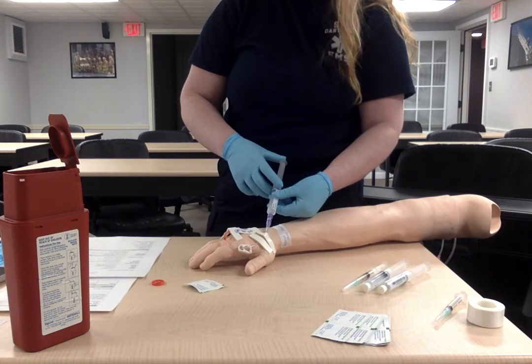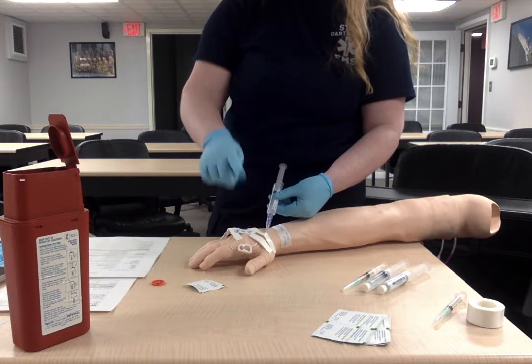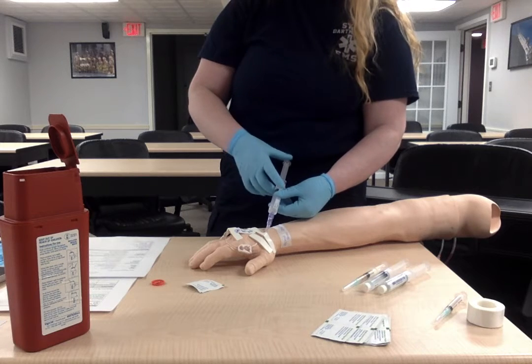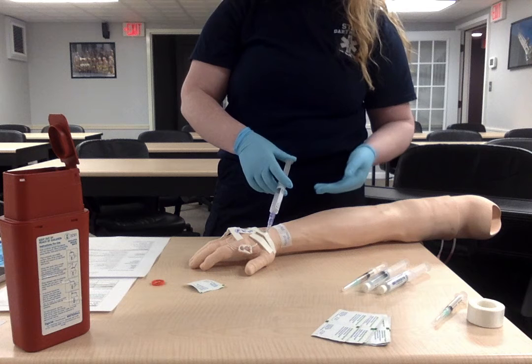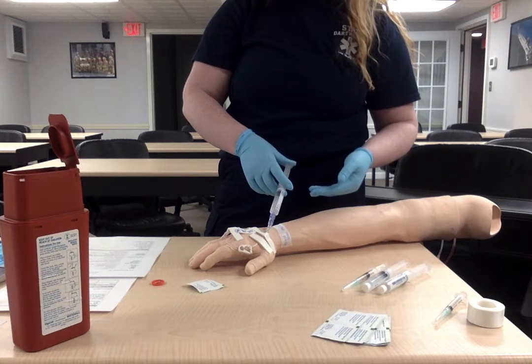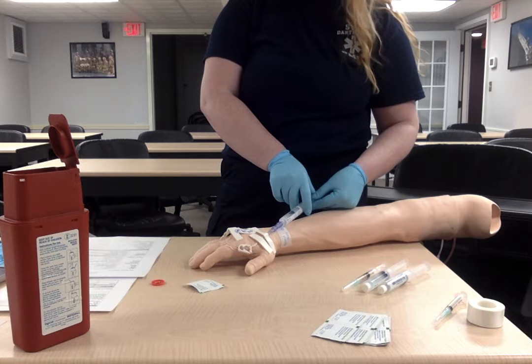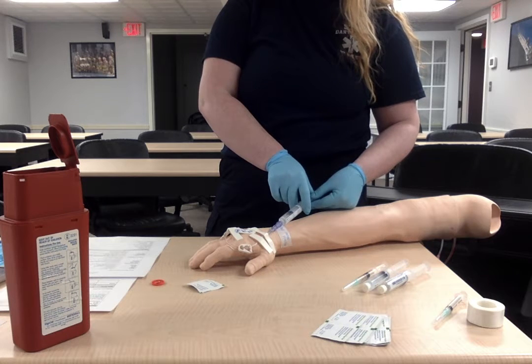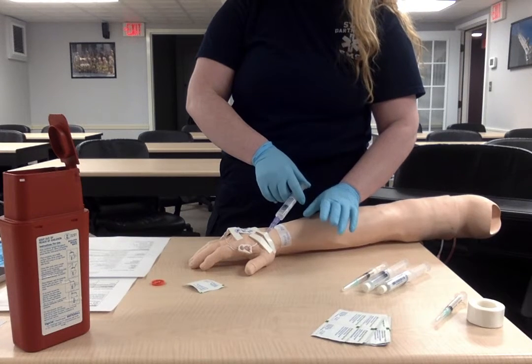We're going to push the 1 to 3 mLs to clean out the lock, just to make sure we don't have any resistance. If you do find resistance, make sure that the clamp is undone, and you never want to push through. So this is just to determine that it's patent and to make sure that we don't have any issues and that we can flush it easily, because we don't want to force that. So there's no swelling, no discomfort as we're doing this, which is what we want to see.